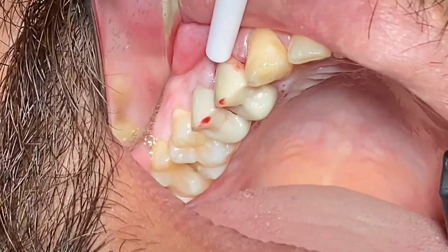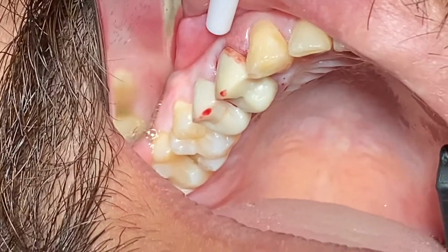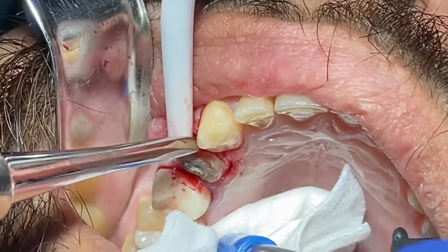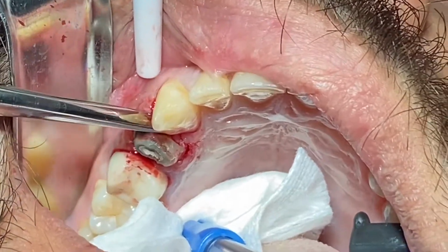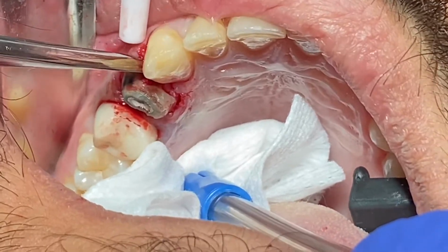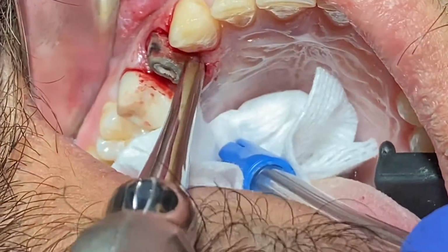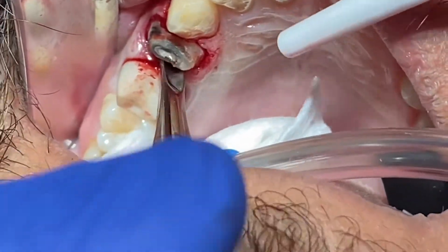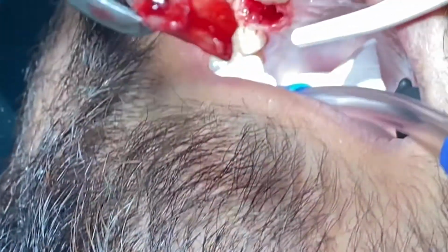So what I'm gonna do is try to remove this tooth atraumatically and try to place the implant on the same day. And I'm just gonna show you the whole entire journey, how we go about removing this tooth, take out the tooth, put the pilot drill, put the implant in, and then put the bone graft, and then how the gum turns out.